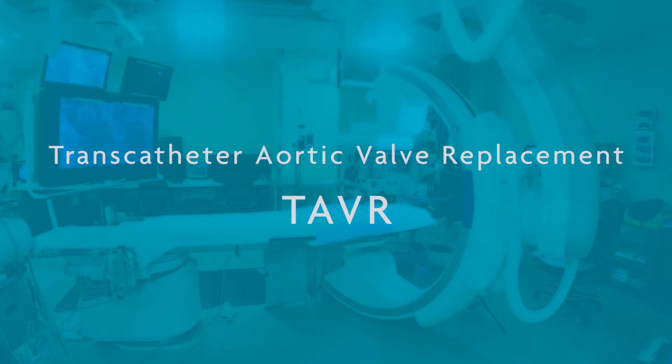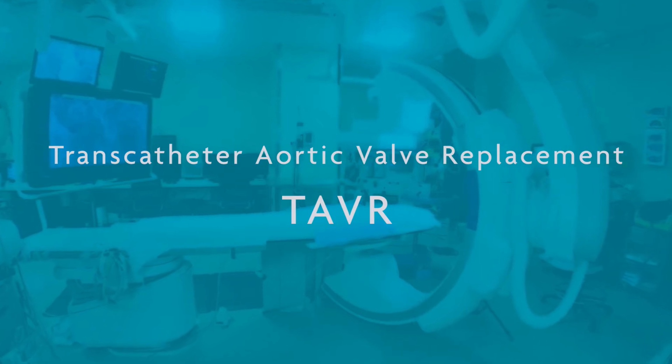So today we want to talk about transcatheter aortic valve replacement, also called TAVR. This is a procedure that has been around now for a little bit more than 10 years. Initially, it was designed for elderly and frail patients with aortic stenosis that could no longer undergo open heart surgery.